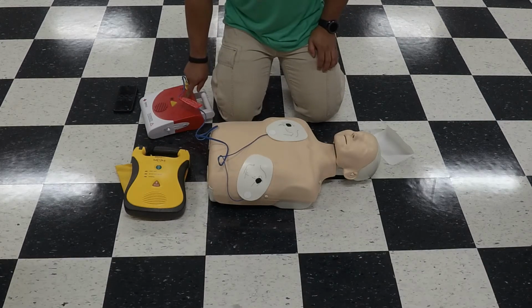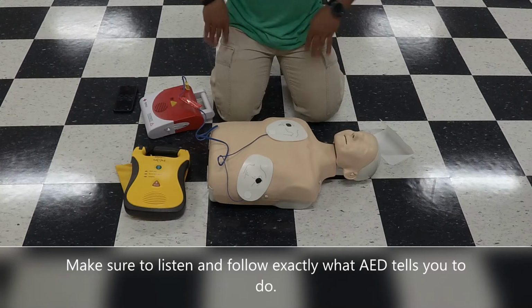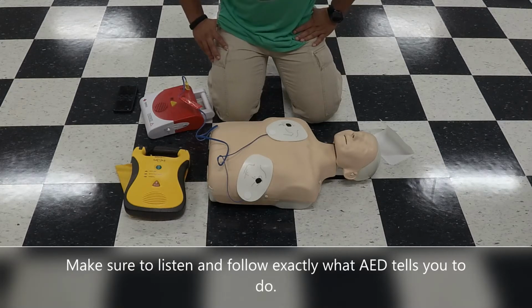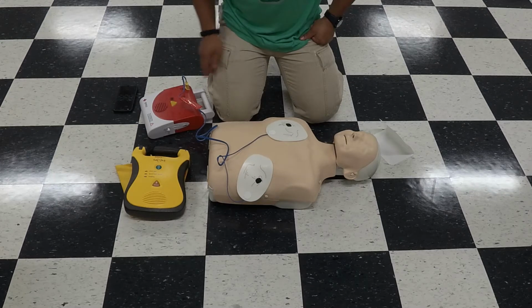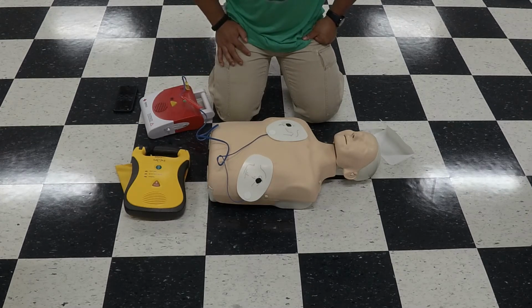Turn on the AED. Analyzing rhythm. Everyone stand clear. Shock advised. Charging. Everyone stand clear. Push the shock button. Shock delivered. Begin 5 cycles of CPR.